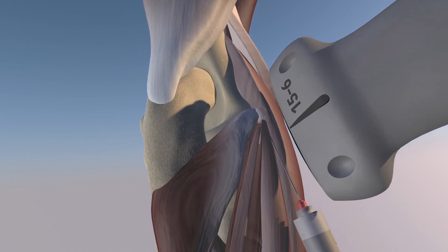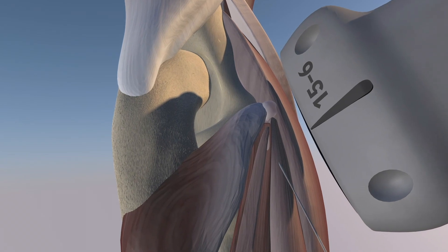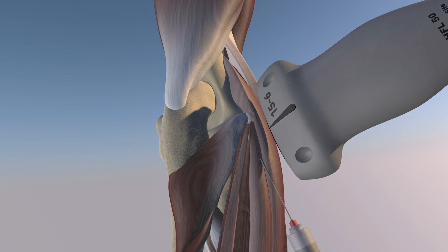We're trying to break up the wall to prevent it from recurring. Here we're just zooming in, and now we're starting to do more of a fenestration dedicated at the origin of the common extensor tendon. This is an in-plane approach, and you can see the shaft of the needle during the procedure.